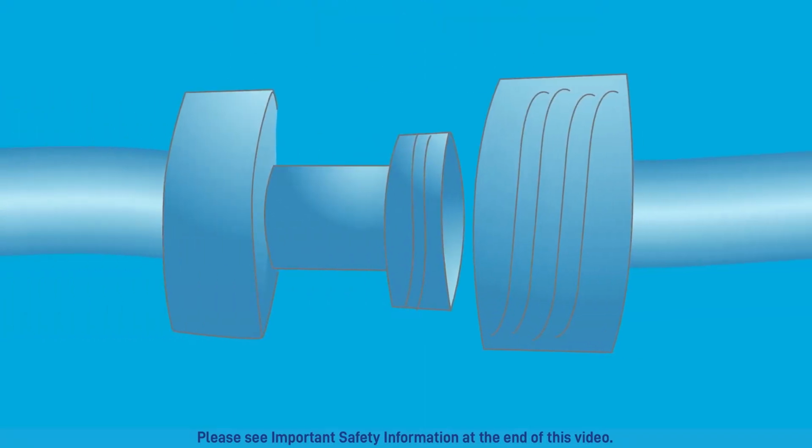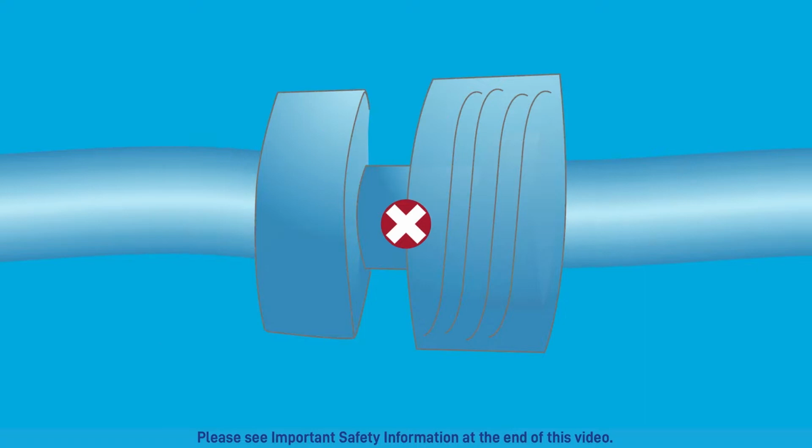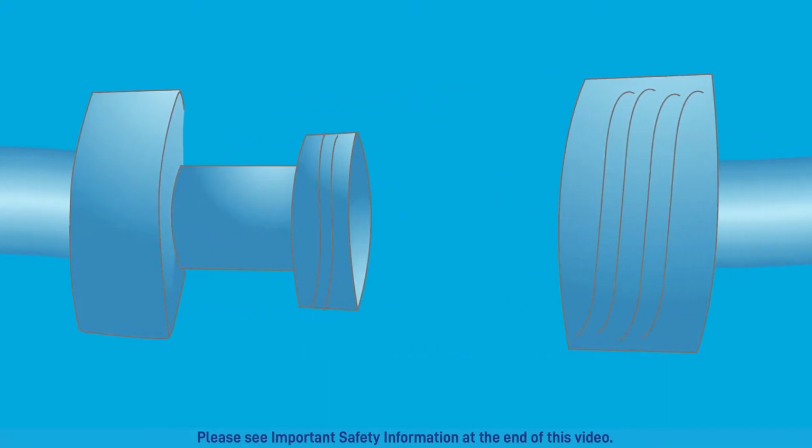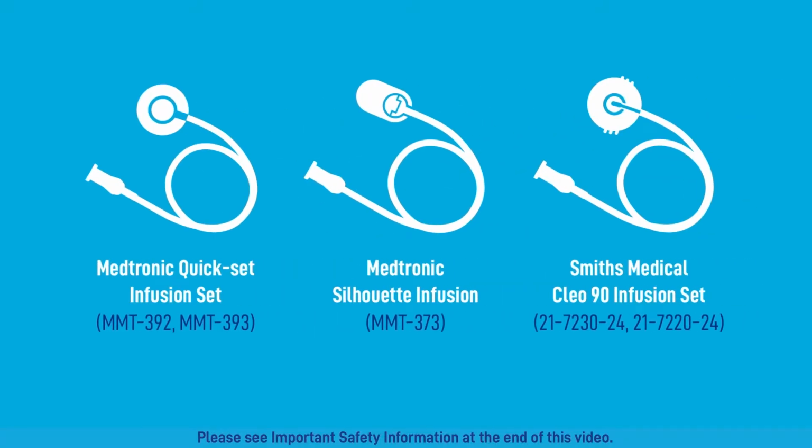If you cannot connect a cassette to your infusion tubing, there may be a damaged connector on one of the components. If the connector on the cassette is damaged, discard it and obtain a new cassette. If the connector on the infusion set is damaged, discard it and obtain a new infusion set. Another possible cause may be that the infusion set you're using is not approved for use with the cassette. Make sure you're using one of these approved infusion sets with the cassette.